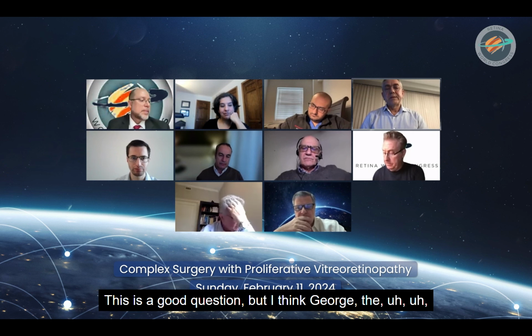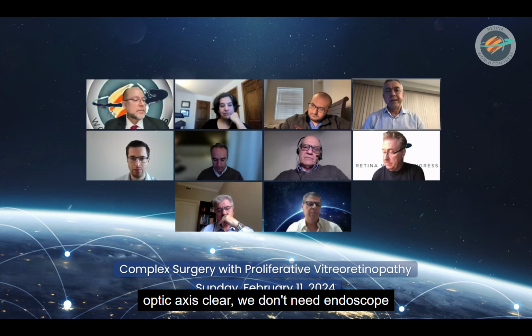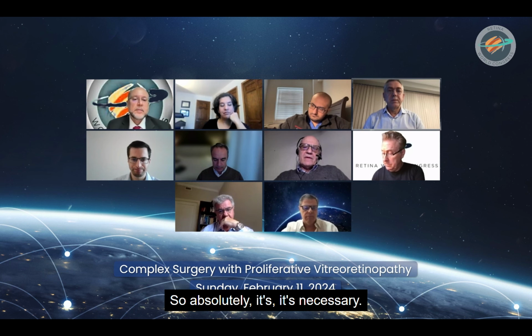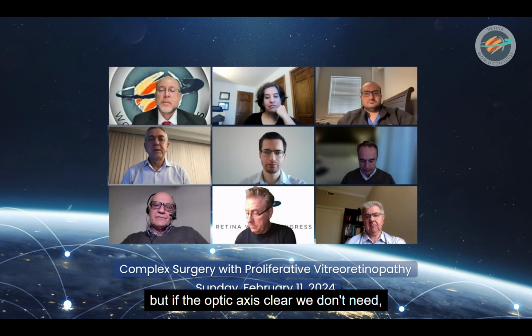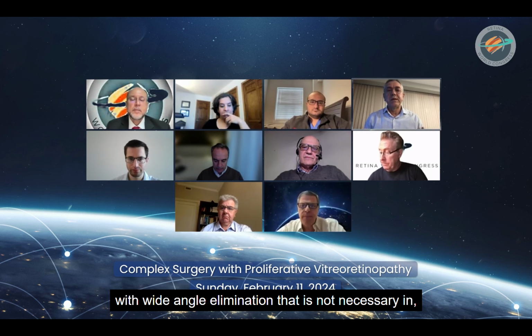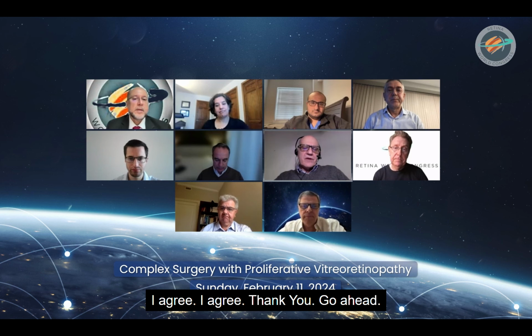Yeah, this is a good question, but I think, George, if the optic axis is clear, we don't need the endoscope. But if the optic axis has some problem, then absolutely it's necessary. Maybe it's much better than the others. But if the optic axis is clear, we don't need it. We can see the vitreous space perfectly with indentation, with wide angle illumination. I think it's not necessary in standard patients. I agree. Thank you. Paulo, move ahead.